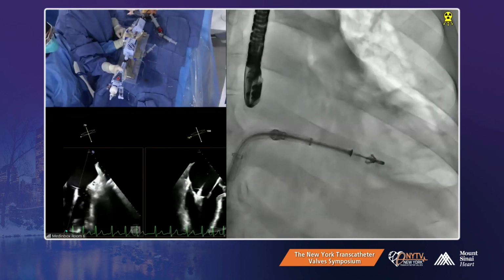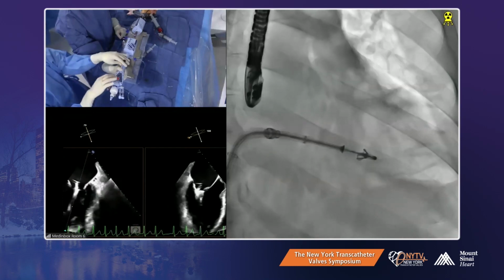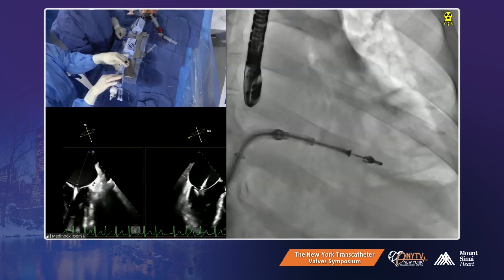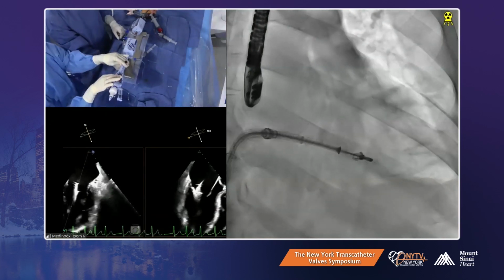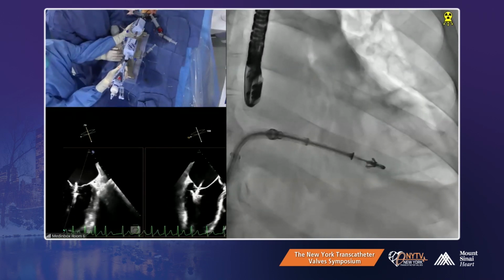Push and hold. The heart rate is very hard to push and hold. You're very biased from anterior to posterior. Your trajectory is not perpendicular in the LVOT view. Then why don't you go lateral, grasp it, and then come to the center? We're trying. That's why I'm saying maybe a little bit of plus.